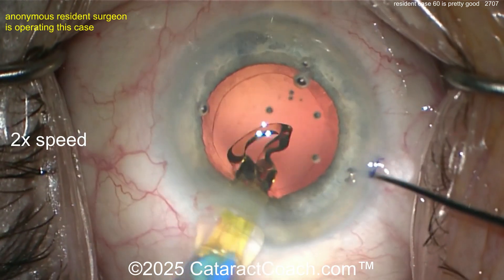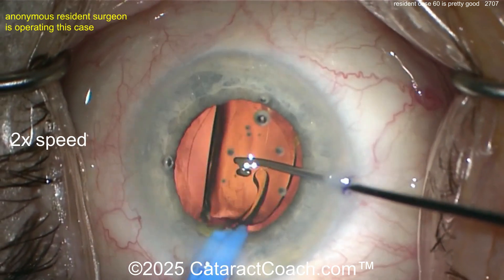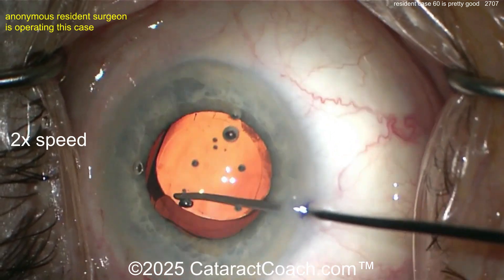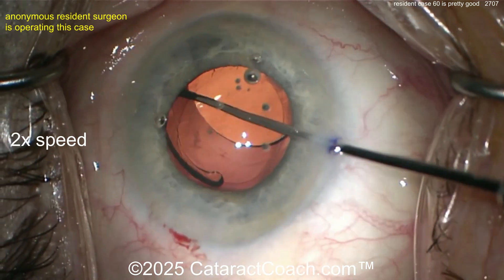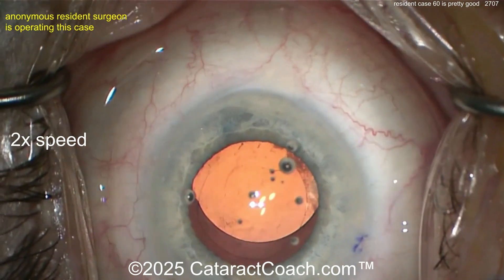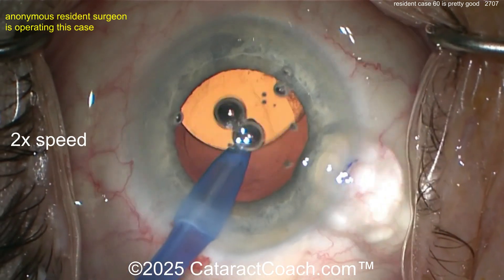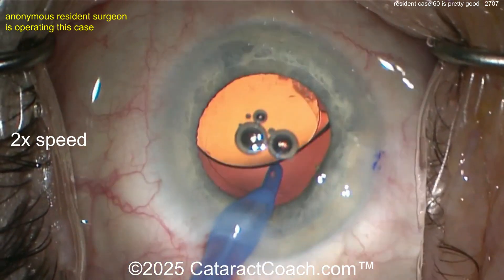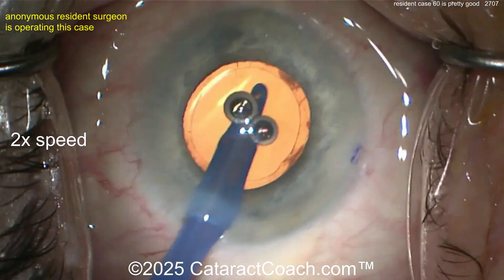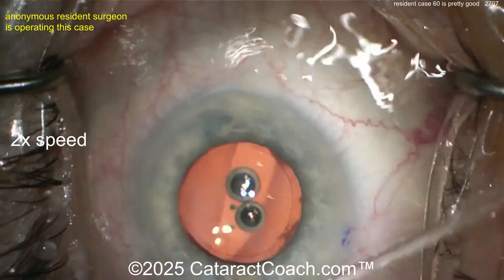Here's the viscoelastic filling the capsule bag. Let's see the lens going in — looks like someone loaded it for you, looks like a single-piece acrylic lens, pre-loaded. You can just use one hand. The left hand's injecting it, the right hand's using the second instrument — this little button device or hook — getting that lens into the capsule bag. Looking really nice. I like how you left a little bit of a gap so you can go under the optic to remove the viscoelastic. The rhexis overlaps the optic 360 degrees — that's just darn good, that's a nice looking case.